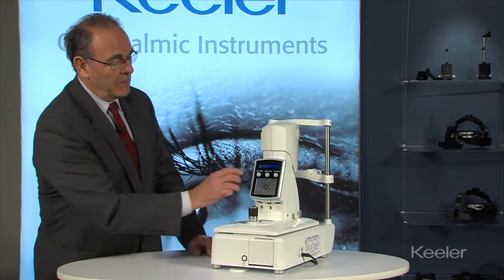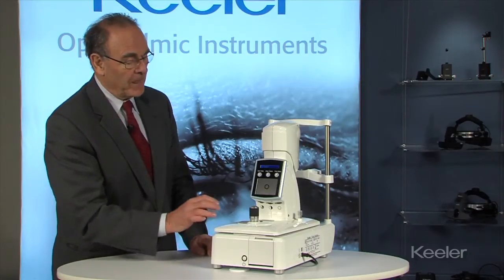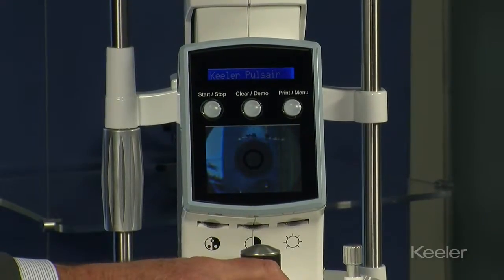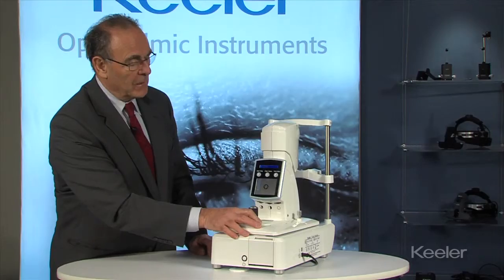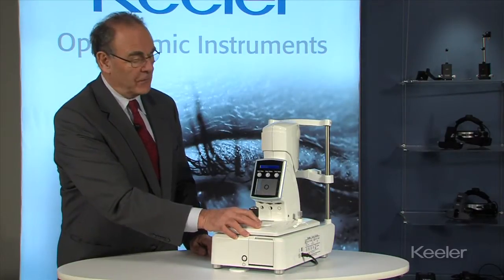On the left here we have a start/stop button which will put it into standby. If you move the table it will automatically activate, as there is a sensor in the machine. If you leave it on for more than two minutes in standby it will automatically turn off.